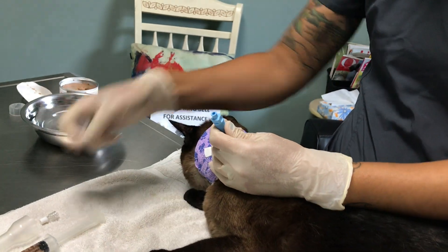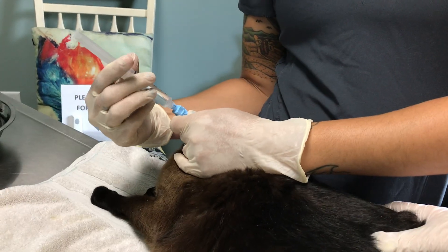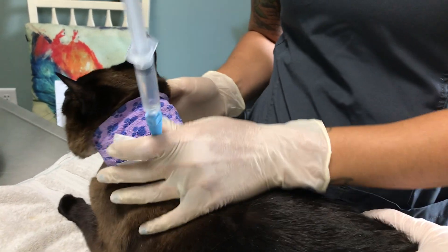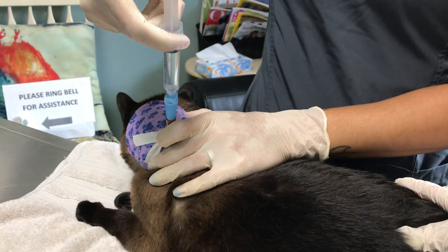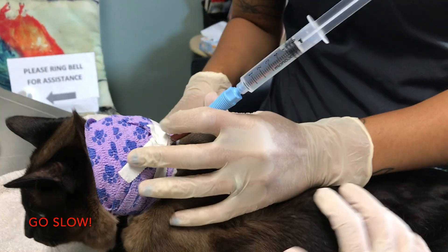What we do is take our little cap off of our Christmas tree port here, and then our syringe will actually fit nicely on there. We like him to be sitting in a nice sternal position like this, and then we can just administer the water nice and slow. If he'll cooperate here, hopefully you can see him swallow a couple times.